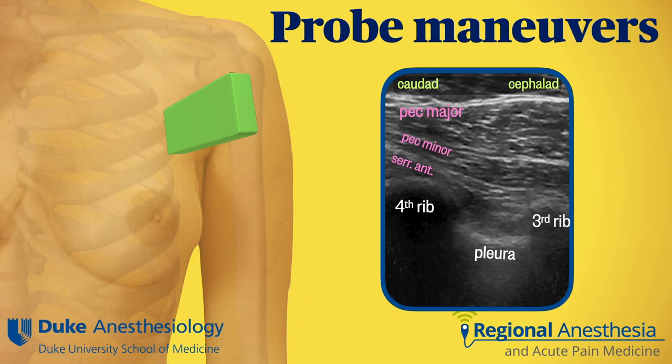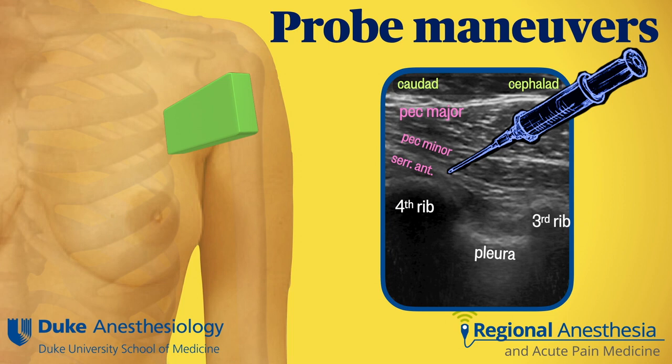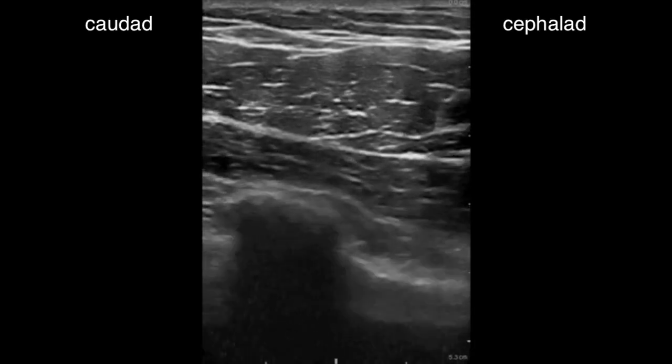Usually at this point we can see a new slip of muscle that appears overlying the rib underneath the PEC minor. This is serratus anterior, and the plane between these two muscles, PEC minor and serratus, is the target for the PECS 2 block. Okay, let's look at this in real time.